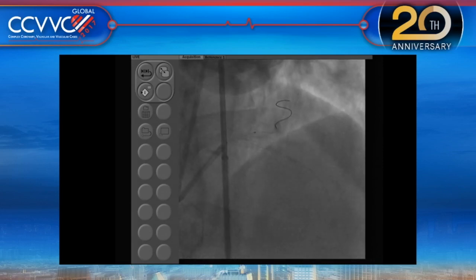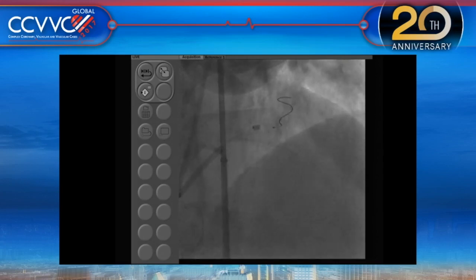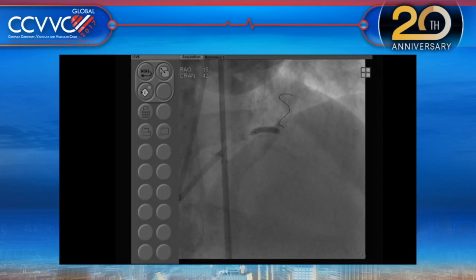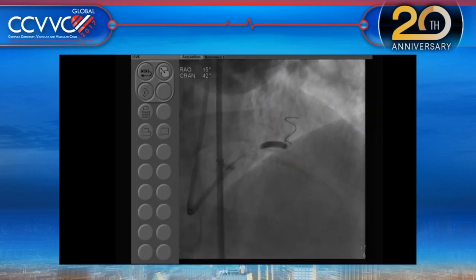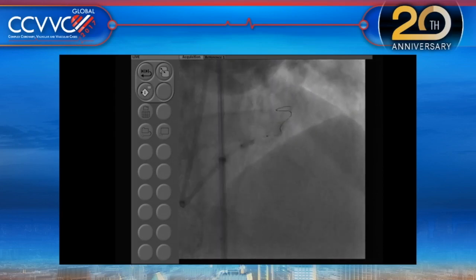I'm seeing IVUS again. When would you ever use OCT for anything in this area? Because I keep hearing everyone wants to use OCT now, but all the data is for IVUS. Let's ask the question to the panel. Can the panel tell me when you ever use OCT at all? Stefan, do you use OCT? What do you think, do we learn more with OCT or?